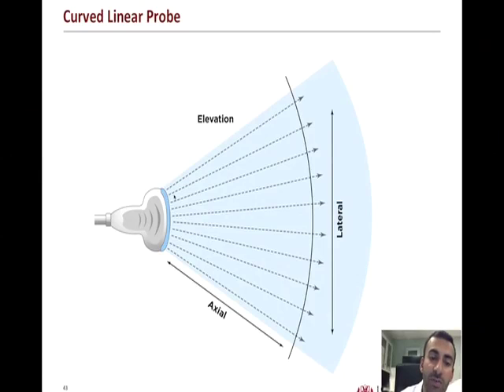And by making it a curved nature, as it goes further and further away, the ultrasound wavelengths will expand and allow you to have a wider image as you go further and further away from the ultrasound probe, because again, the footprint is in a curved fashion.